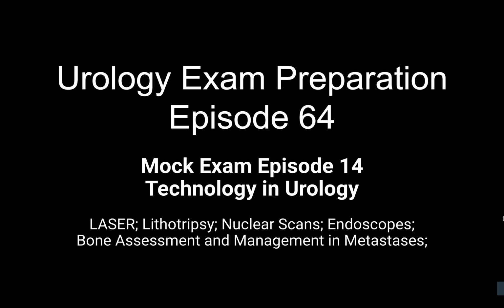What other things may you be doing in reusable scopes but not in the digital scopes? Anything specific? I'm not sure. Okay, and because of being digital, ergonomically, is there any difference for the surgeon? Well, for the surgeon, no. The fact that they are digital means they are usually not as flexible at the tip compared to the fiber optic. Otherwise, there's no difference.